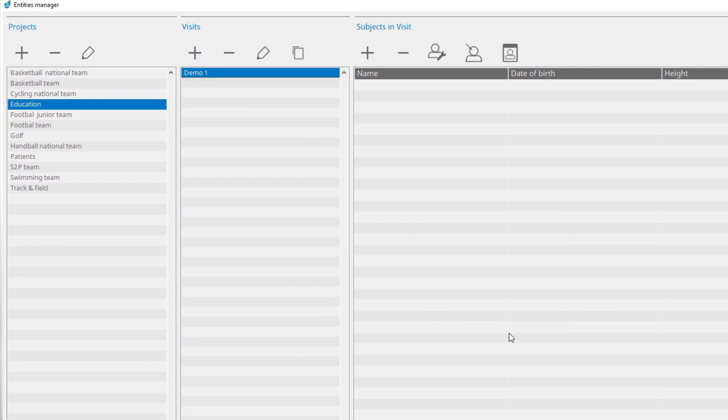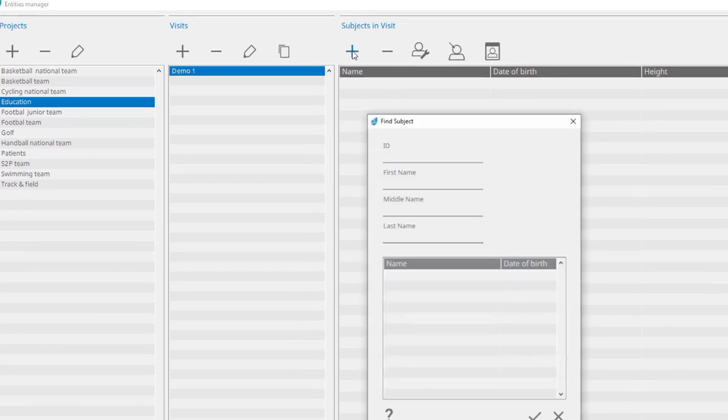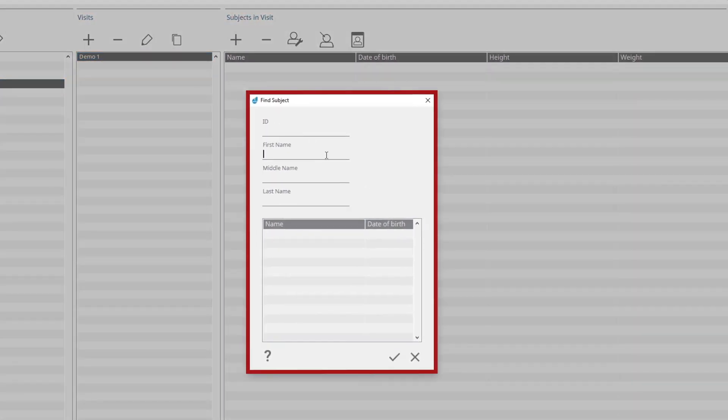After creating a project and visit, add a subject to the visit. Create a new subject by clicking on the Add button in the Subjects in Visit panel. Fill in the first and last name of the subject.